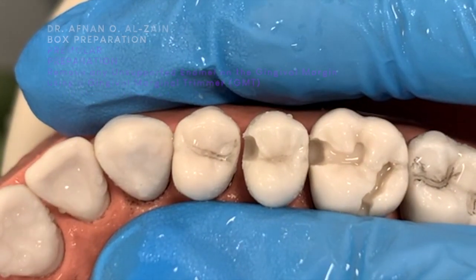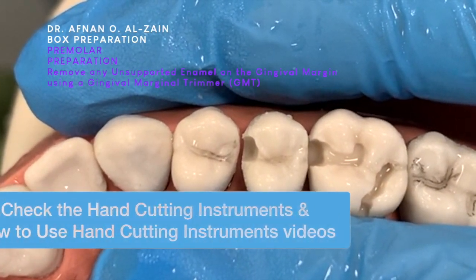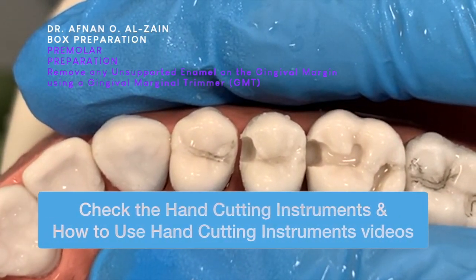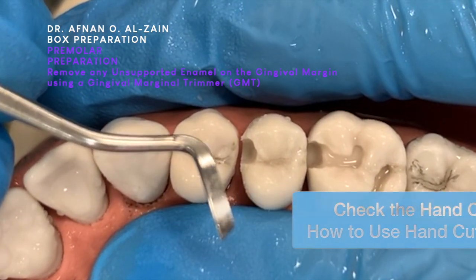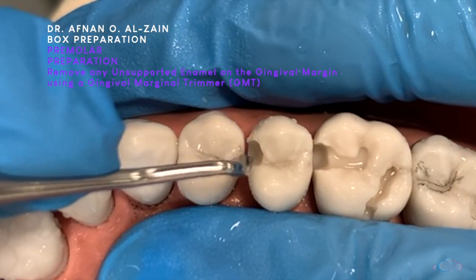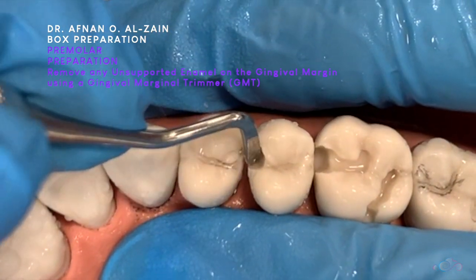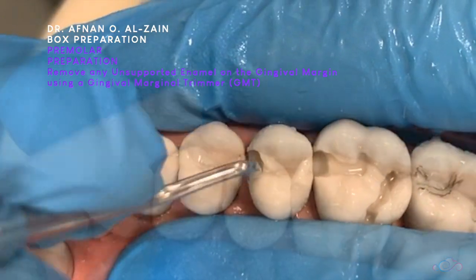If needed, you can go with the GMT to remove any unsupported enamel at the gingival margin, in a scraping motion.